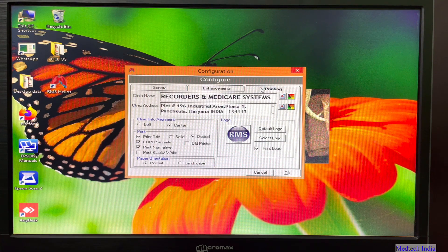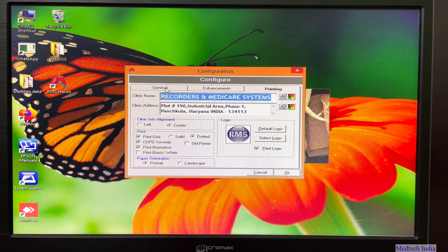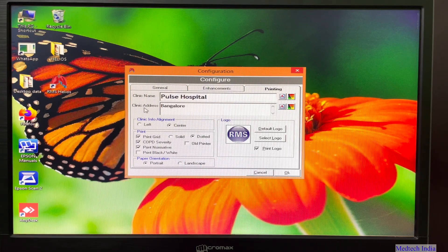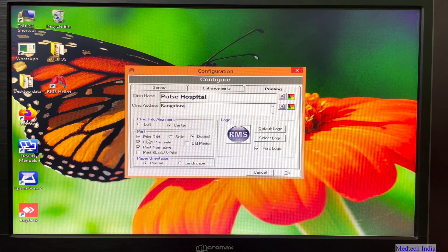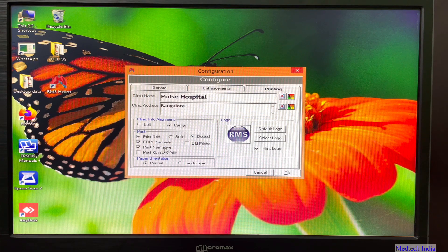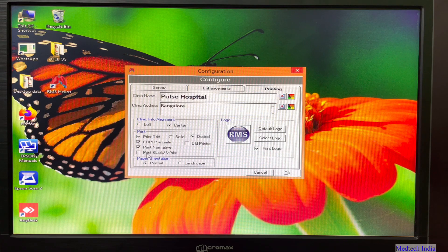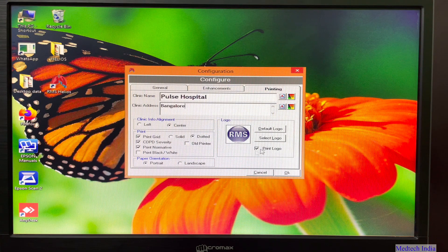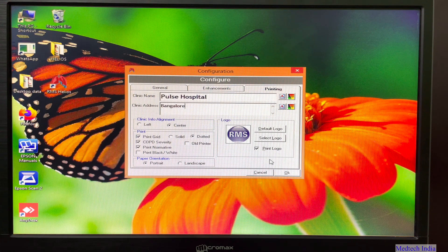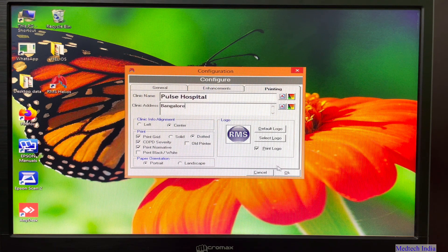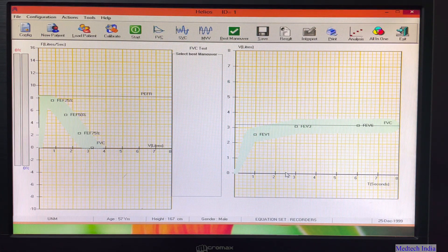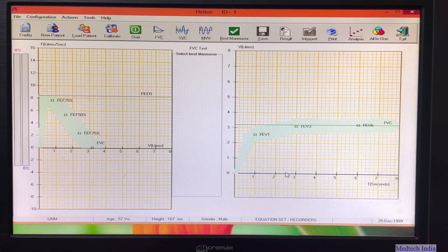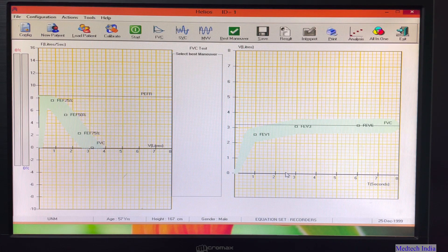Then go to printing. Here we can change clinic name and clinic address. There are other printing settings also available such as info alignment, print grid solid or dotted, print on black and white paper, paper orientation portrait or landscape. And we can change the logo also. You have to go to select logo, you can select your hospital logo. Then press on OK. Now after clicking on OK, you will get graph window. So it means your device, your software is ready for performing the test now.